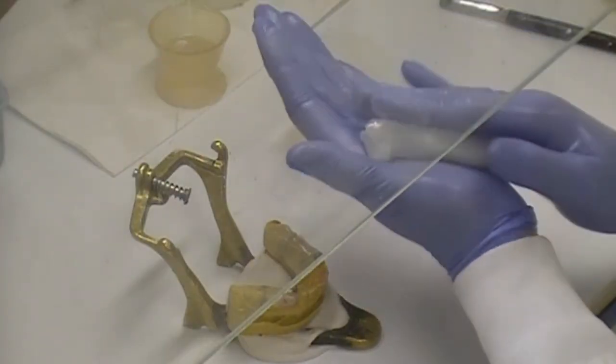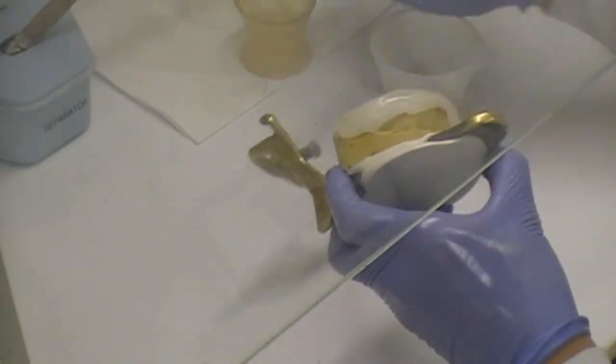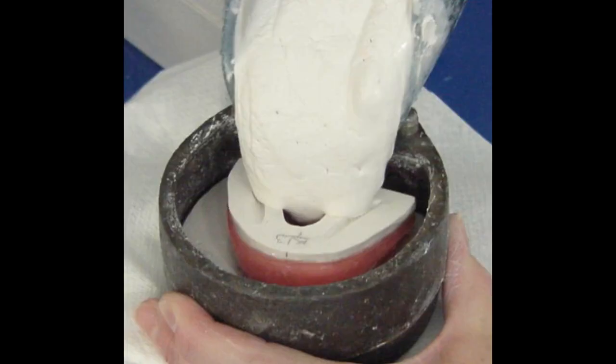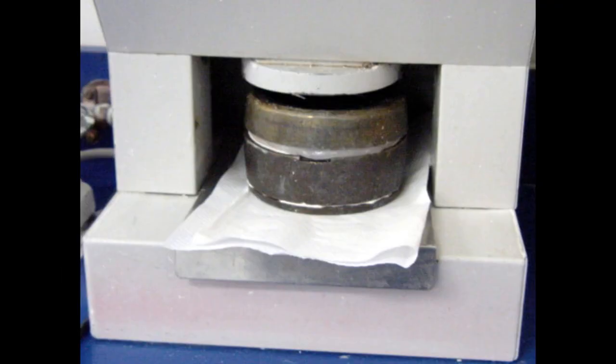The Veriflex acrylic may be processed using the hand adapted method or flasking process. The flasking process involves creation of a waxed appliance, investment, wax removal of the appliance, and packing with Veriflex acrylic.